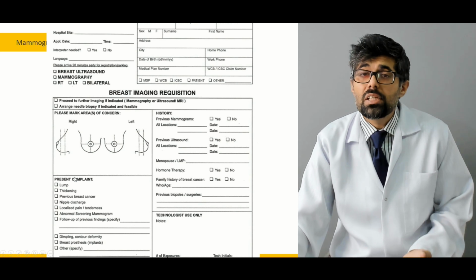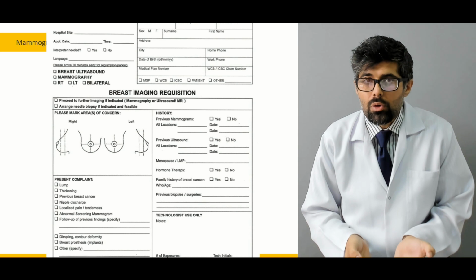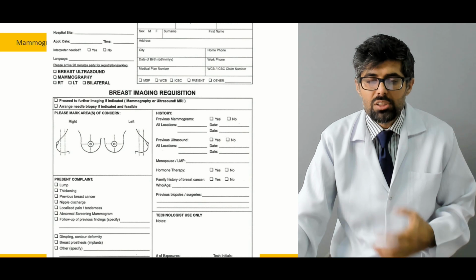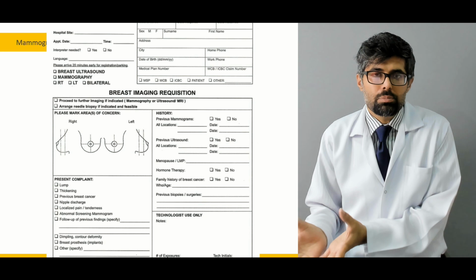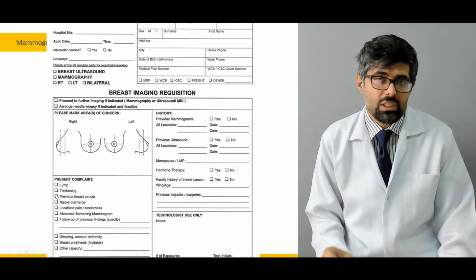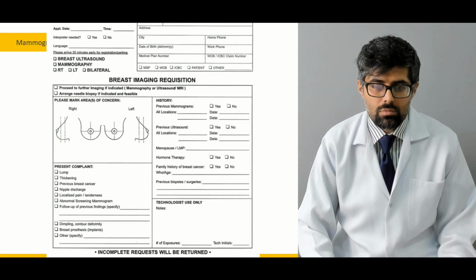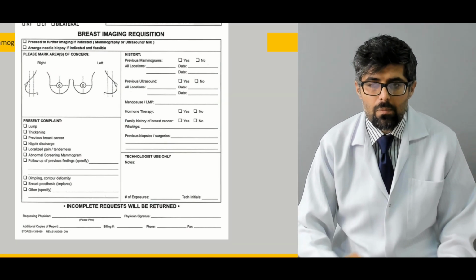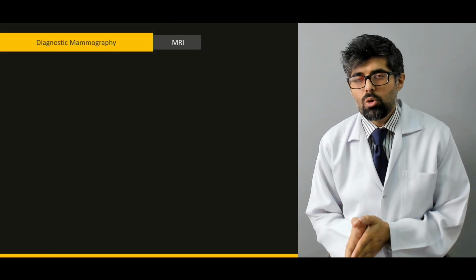If the discharge is there, is it serous, is it mucoid, or is it purulent? That would indicate that it's infection, or if there's some kind of abnormal dimpling or contour or deformity that is present. Now all of these can only be done again if your physical exam is good. There's the rest of the form, and then we move on to the diagnostic mammography.